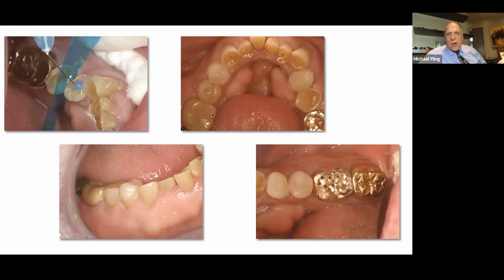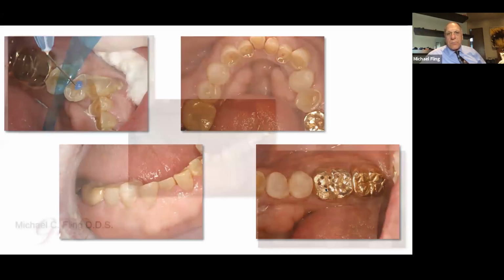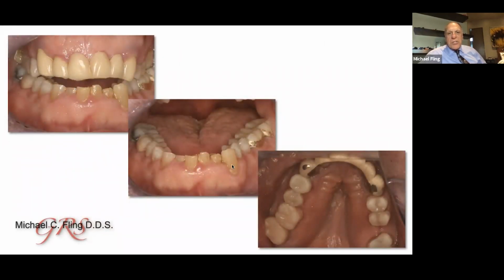When I got back here to the crowns, this gold crown, I went in with a small round burr and I created mechanical retentive areas. And I ran flowable composite down in there and I bonded the overlays onto his gold crowns. And here you see where I etched, primed, and bonded the composite overlays onto the occlusal of either his teeth or to his gold restorations or to his porcelain crowns.